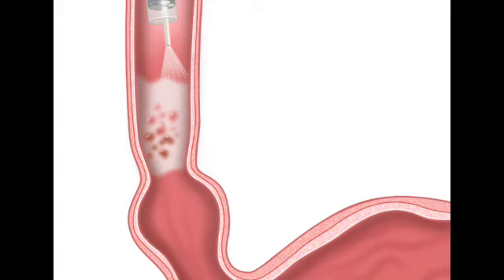That is profound. I mean, the peace of mind that must give a surgeon in the room. Oh, it's immense. Instead of removing the tissue, closing up, and waiting weeks for a pathology lab to call and say, hey, the margins on that sample weren't clear, you left some behind, you need to go back in for another surgery, they can just spray a little vinegar on the scar in real time and know for absolutely certain if the perimeter is clear.